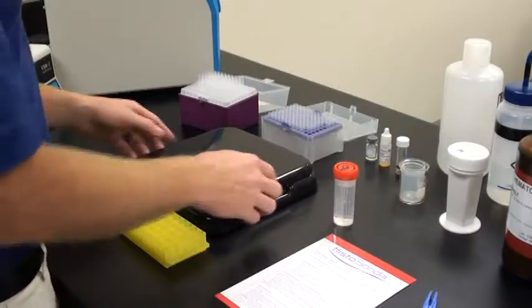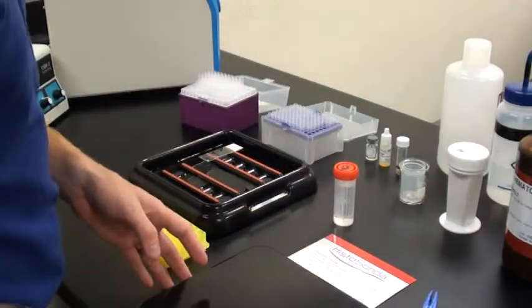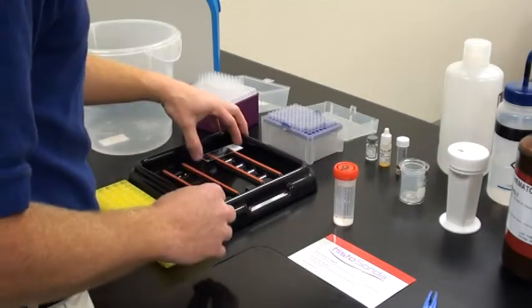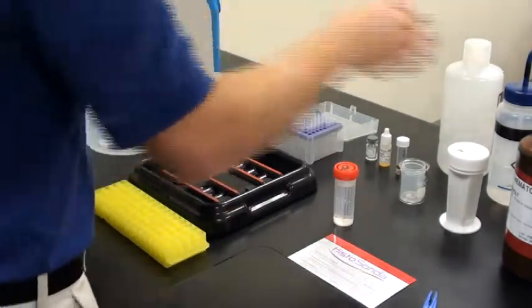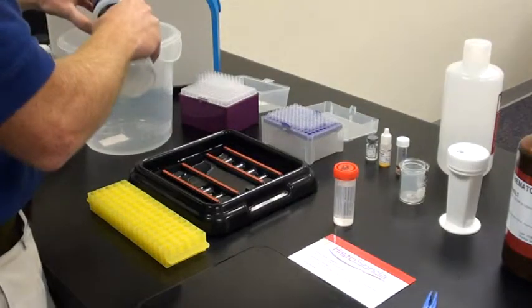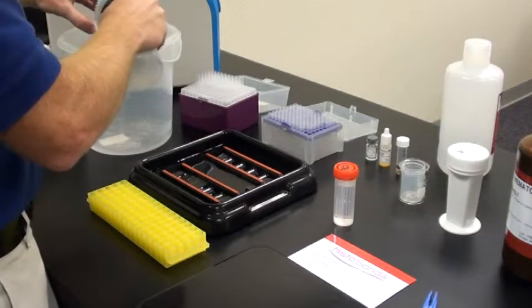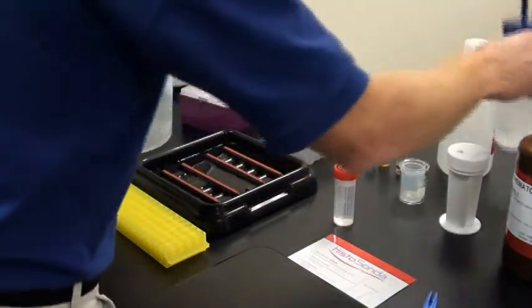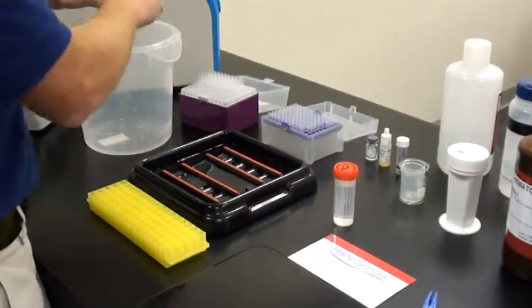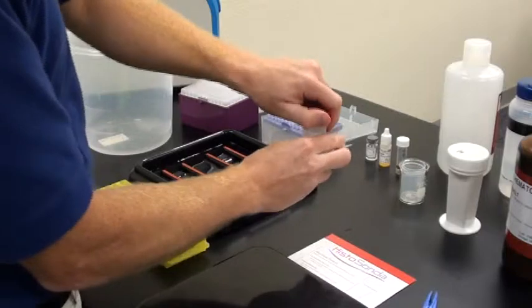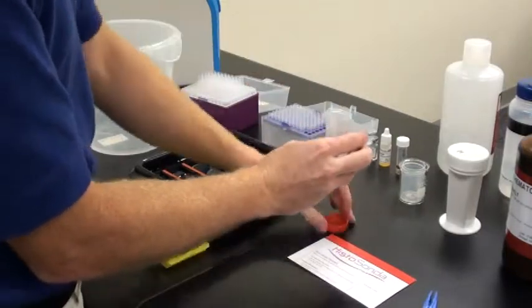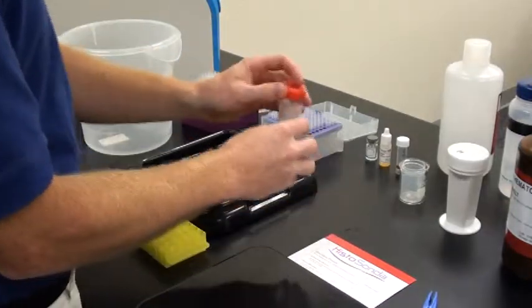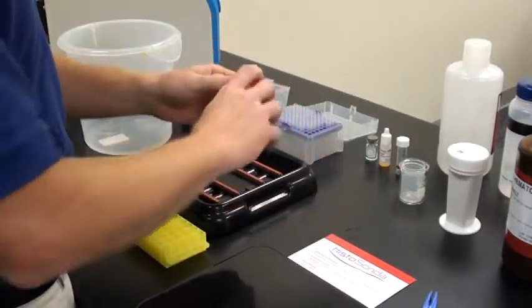After 30 minutes of incubating the secondary antibody, it's time to rinse once again with PBS 7.4. We'll also put the slide back into the slide jar filled with PBS 7.4 and hand agitate or put it on a rocker for 2 minutes.